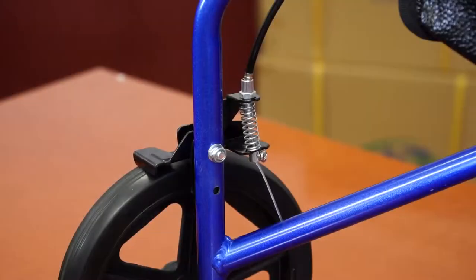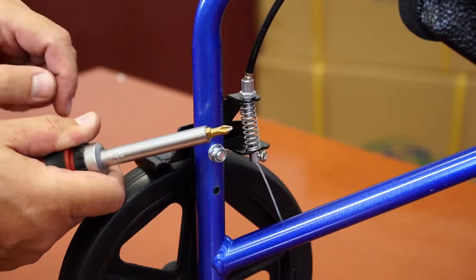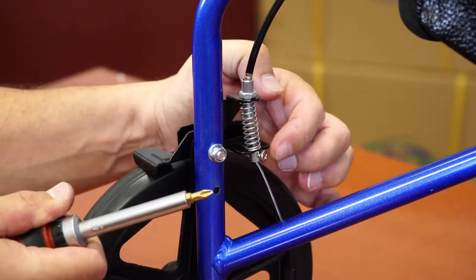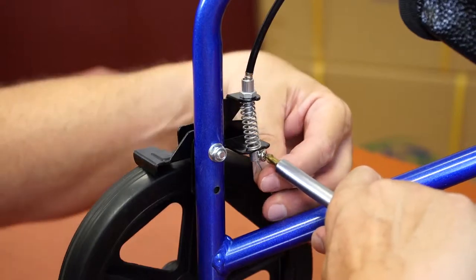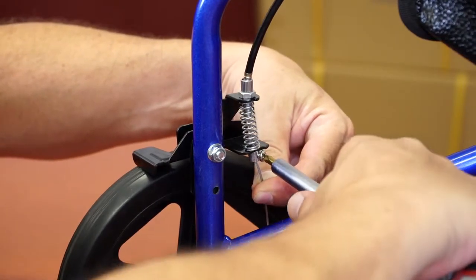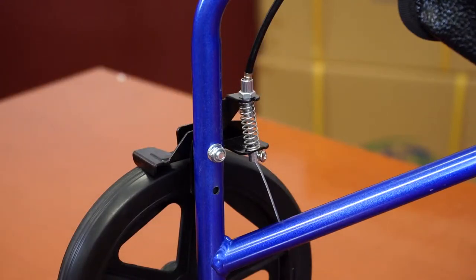Adjusting the brakes. At some point you might want to adjust the brakes on your Rollator. Use a Phillips head screwdriver to loosen the little screw that holds the brake wire in place. Adjust the wire according to your needs. Do not forget to tighten the screw after you are done.